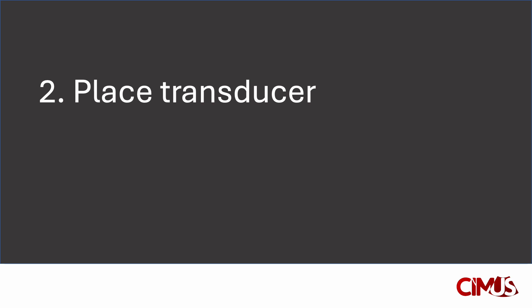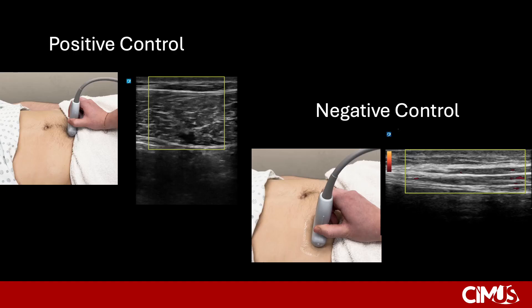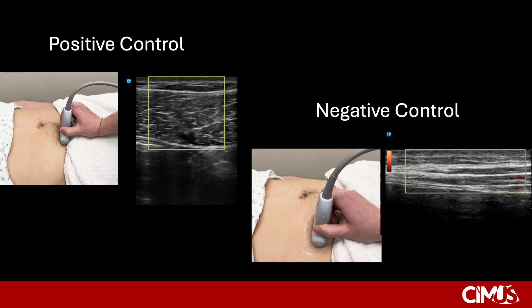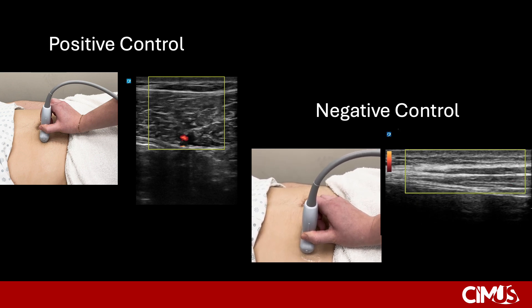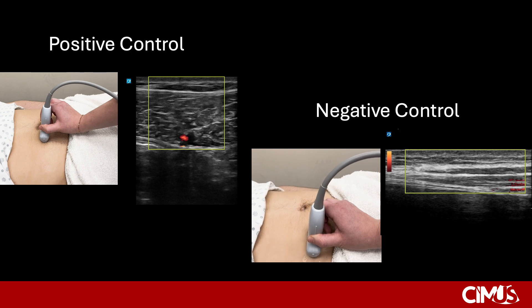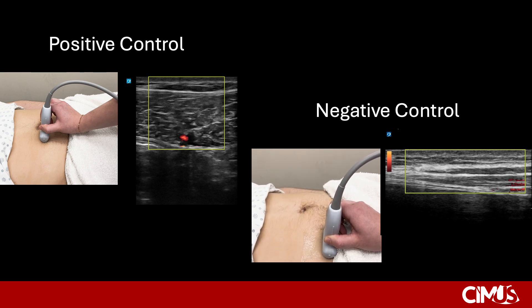Now let's go over transducer placement. To confirm the presence or absence of vessels, you should perform both a positive and a negative control. In a positive control, place the probe over where you expect to see the vessels. Here we have an example of identifying the inferior epigastric vessels. The operator carefully scans the area, and positive identification confirms their presence and lets the operator know which area to avoid. In negative control, the ultrasound probe is positioned where you plan to do the procedure, in this case the right lower quadrant. The operator scans the area to ensure the absence of vessels. It is important to perform both controls, because there are many reasons why a Doppler signal could be negative even when there are vessels in the area scanned.